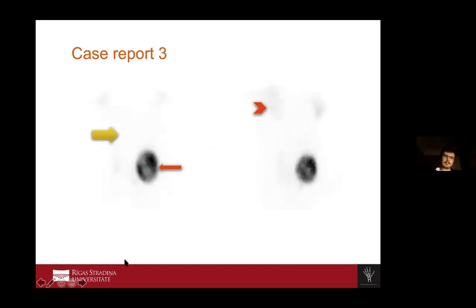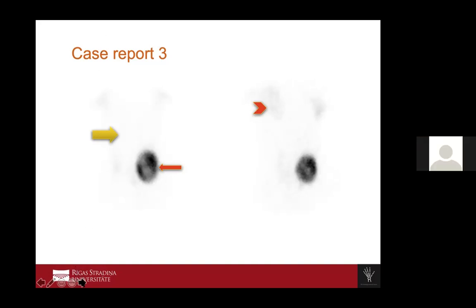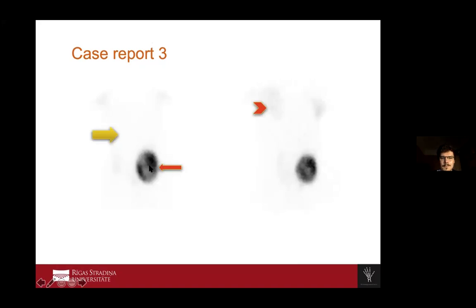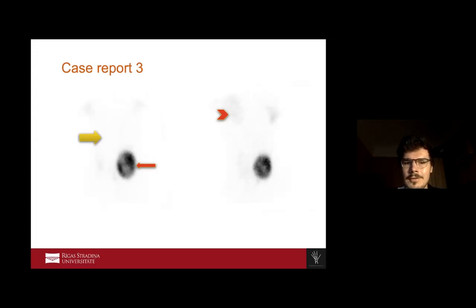Case 3: This is in the neck region — scintigraphy of the thyroid gland using technetium-99m, which is quite common. We see a hot spot, meaning it shows functional activity, as opposed to a cold spot which would be a mass without functional activity. This is an adenoma in the thyroid gland, and we see that the rest of the glandular tissue is very faint and shows no activity.